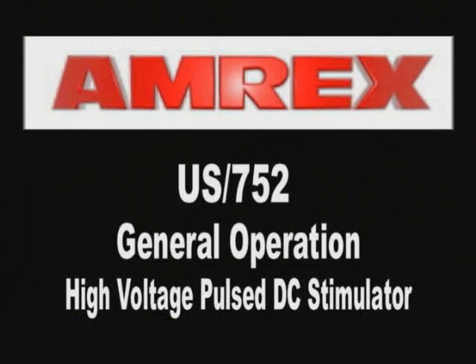U.S. 752 General Operation, High Volt Pulsed DC Stimulator.